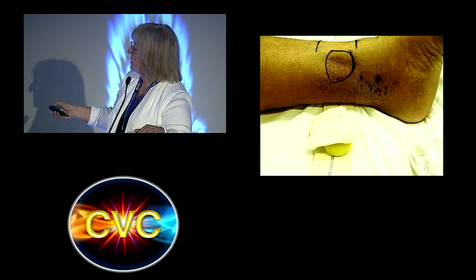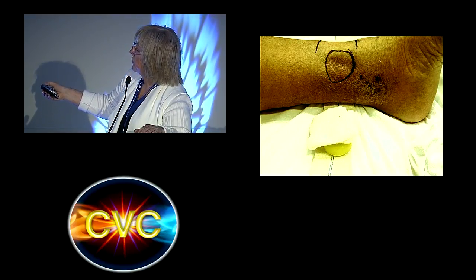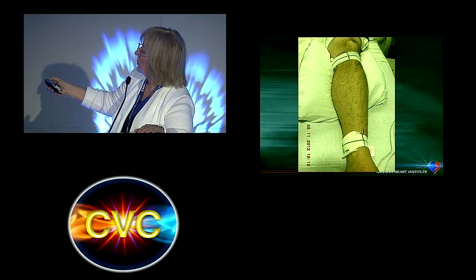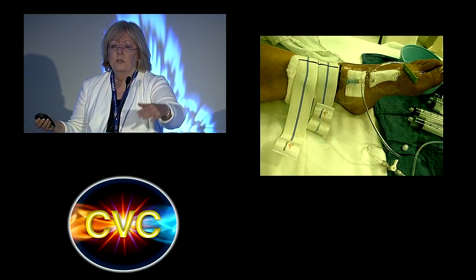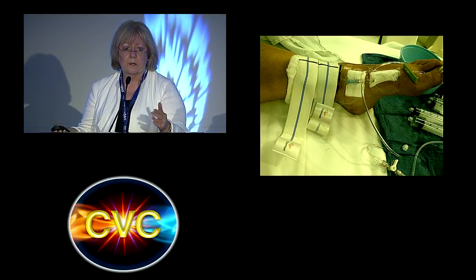It has a little disc here that you can move around so you get it right in the spot you want it. Usually use gauze or a sponge. Put it right here, draw a circle. And then you can put it on like this, and you can put one on at the knee, and compress the saphenous vein against the condyle. And you can just perfuse the entire calf with a dilute solution of TPA and saline for hours.